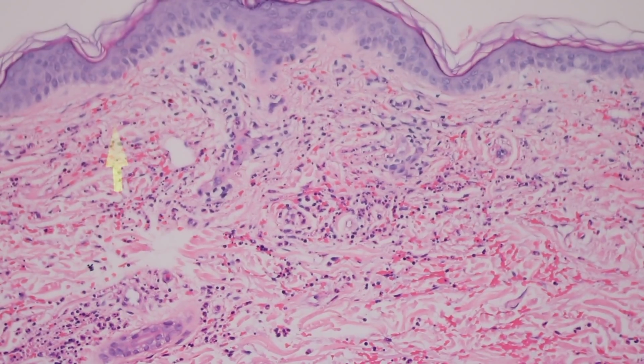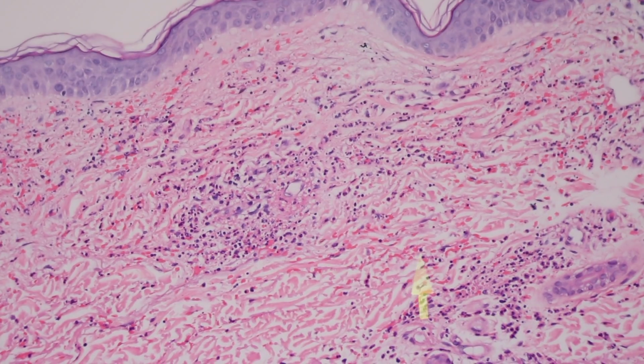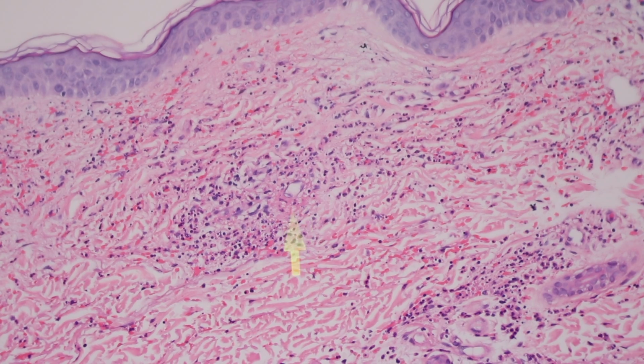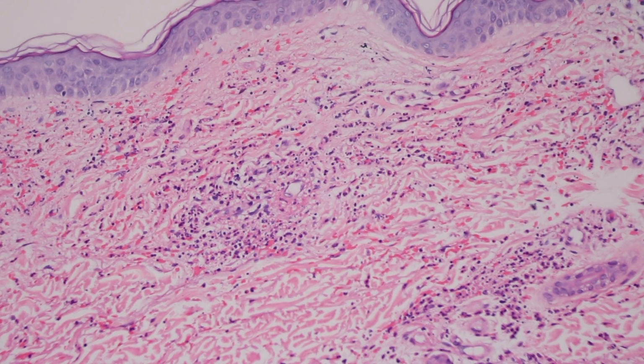So this is a nice example of leukocytoclastic vasculitis. Again, look, here's a focus here. You can see even from lower power, there's the vessel lumen, beautiful layers of pink fibrin around it, and neutrophils and nuclear dust and red cells all extravasated out of the vessel there. So perfect example of leukocytoclastic vasculitis.